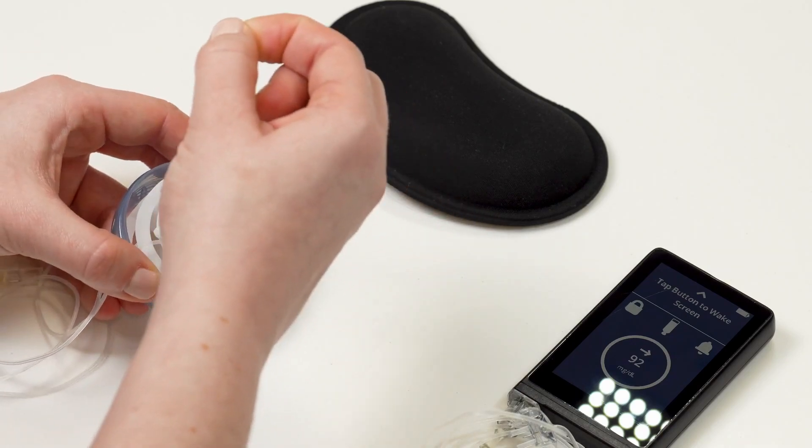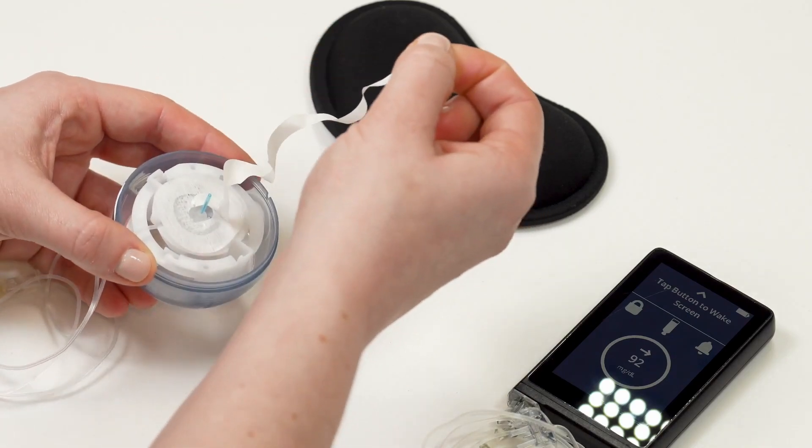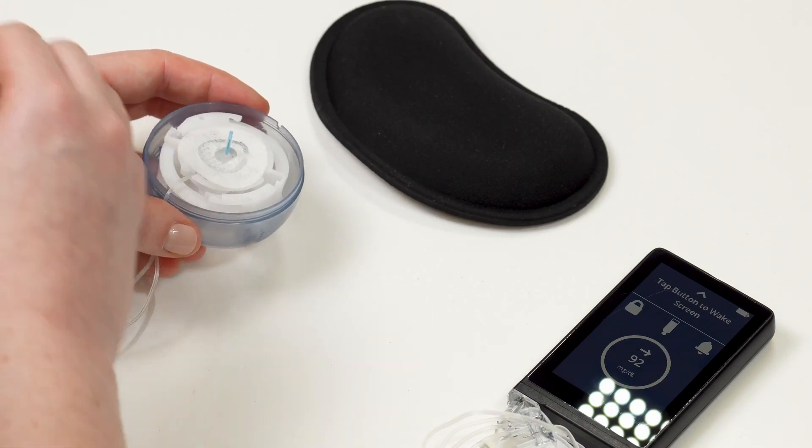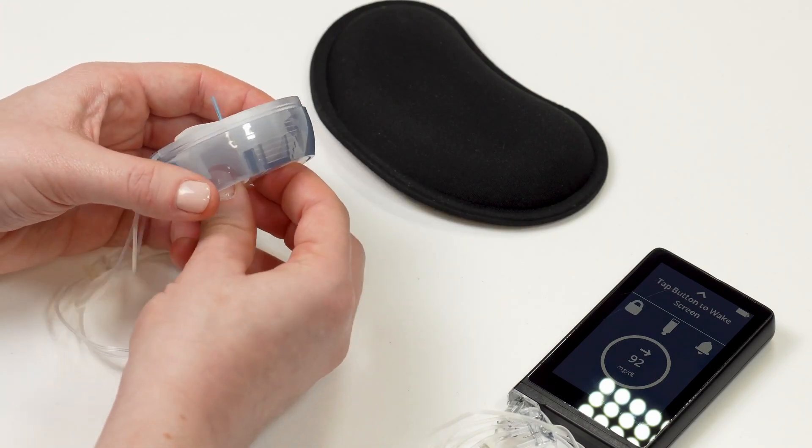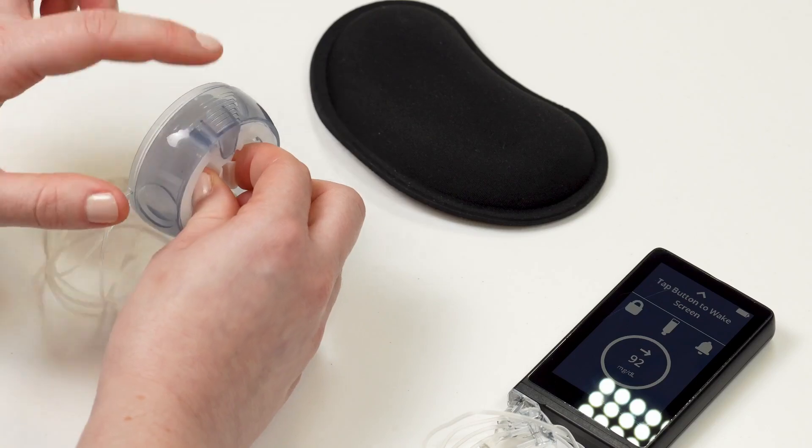Using the pull tab, slowly peel the adhesive backing off of the infusion set. Do not pull too quickly or you will pull the infusion set off of the inserter.